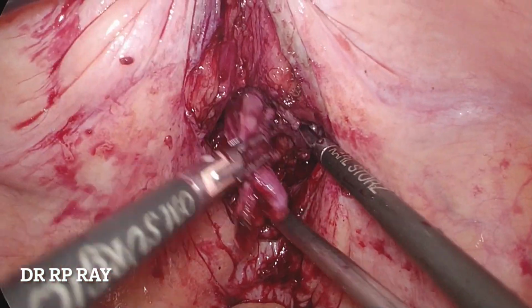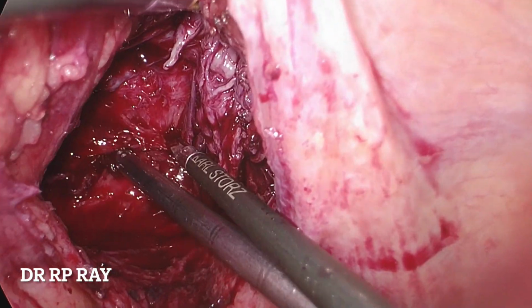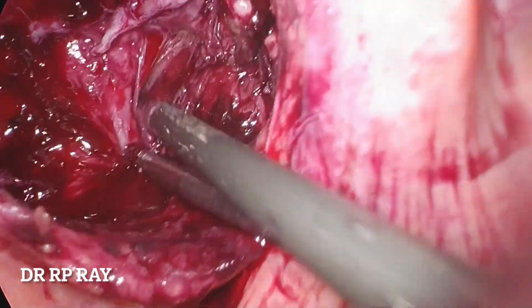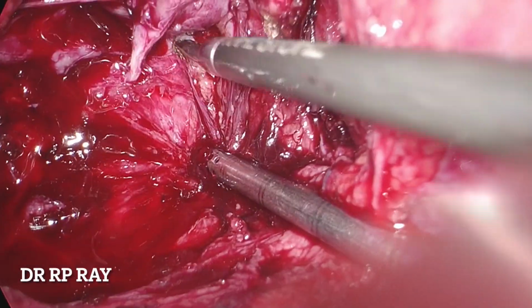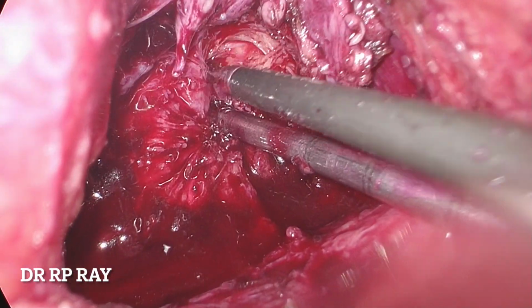Now progressive dissection is continued, and then after the seminal vesicle and the vas deferens are freed, the dissection is continued beneath the posterior surface of the prostate and anterior to the rectum. You can see there are a lot of adhesions.